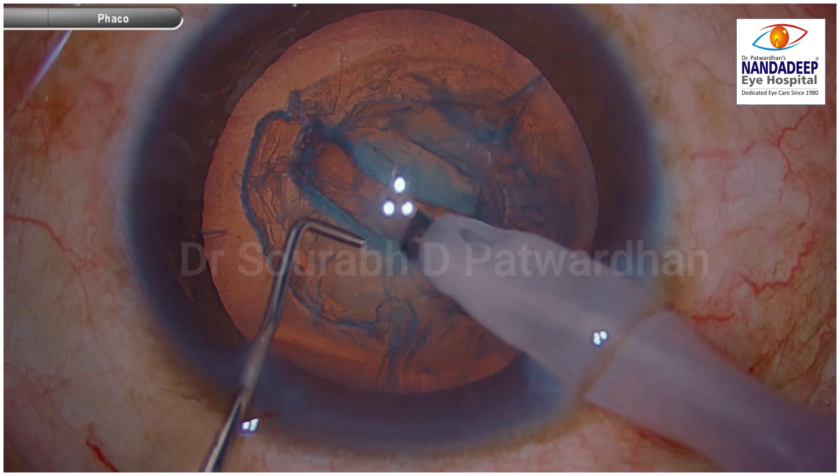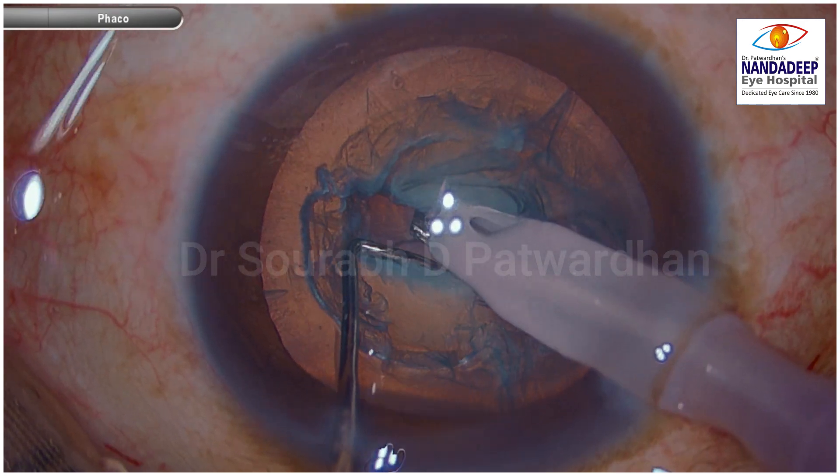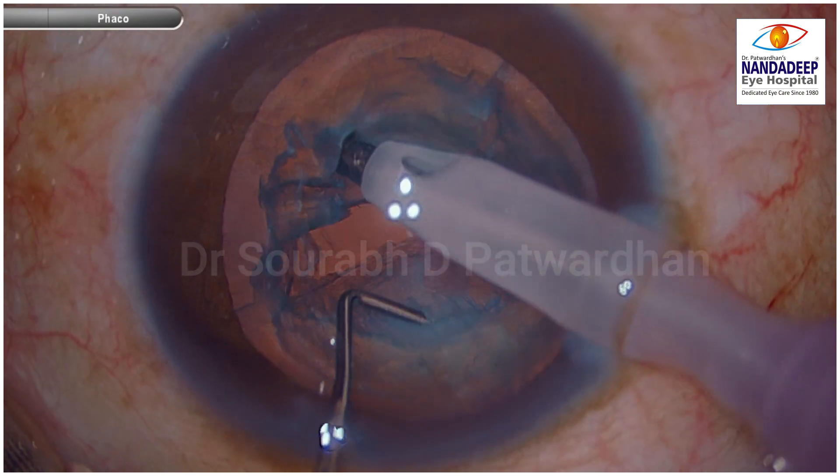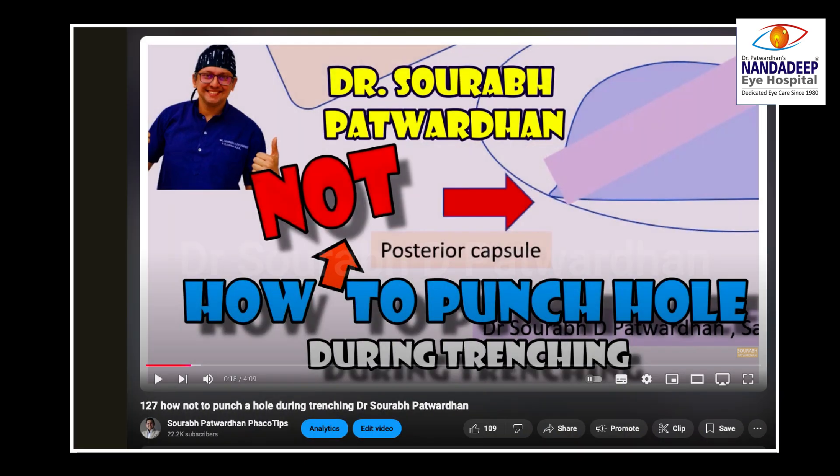So if you see this lit cigar sign, you should avoid trenching in that area. Trench in the other area instead, and then you will get adequate depth throughout.